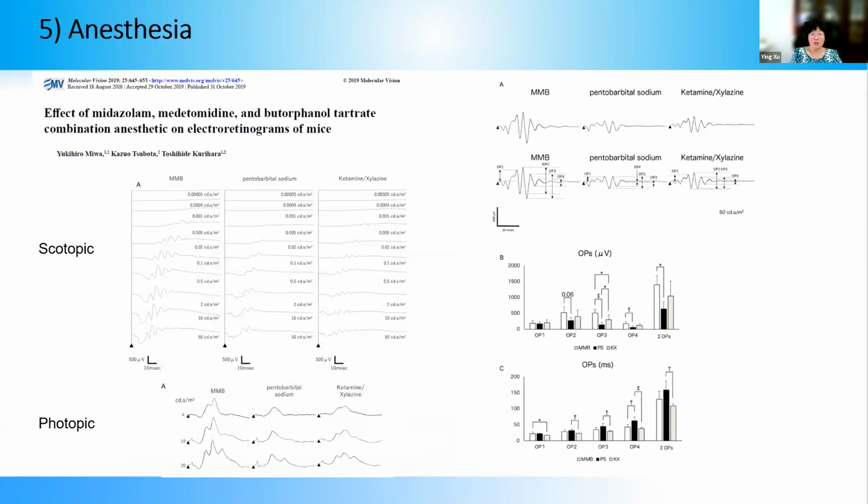And besides all those factors, there's also one major factor that people sometimes ignore, but it actually has a great impact on the ERG recording, that is the anesthesia agent used. So this is a recent study that compared the impact of different anesthesia agents on the ERG amplitude.